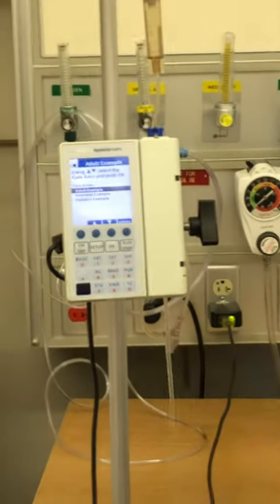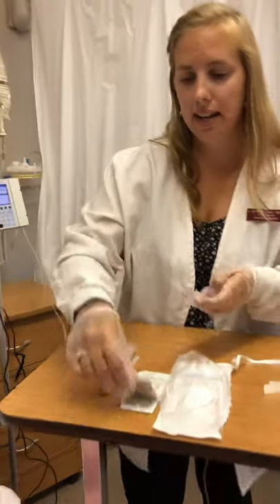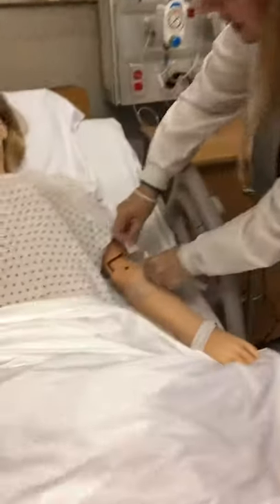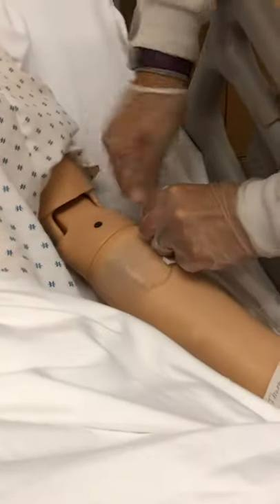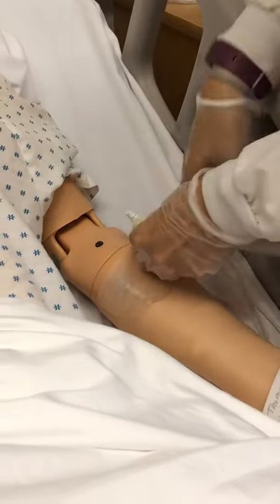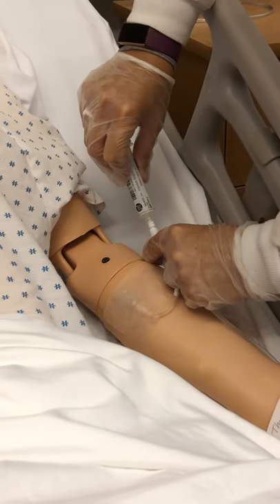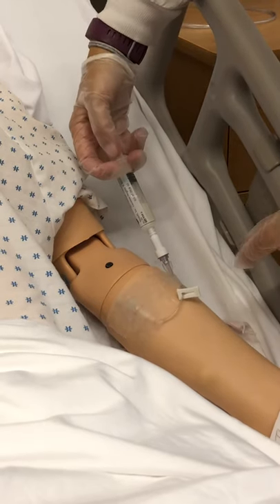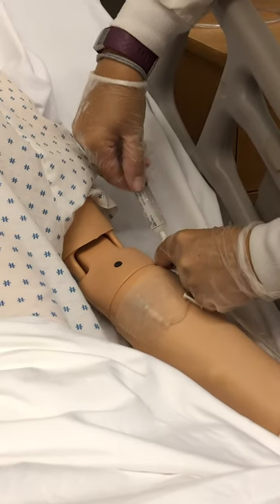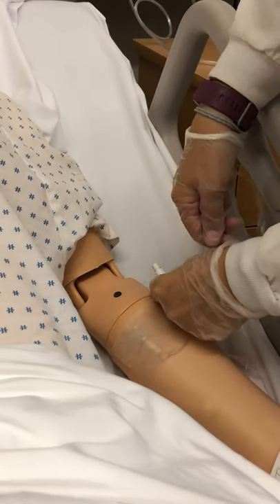The next thing is to hook up the patient. I've done my assessment and the IV site looks great. I'm going to grab my alcohol swab, give the end of the IV a good scrub since it's been laying in the bed with the patient, and let it dry. Then I'll take the cap off my flush — it's a luer lock, so you push and twist — and flush the IV anywhere between three, five, or ten cc's, however much the facility requires.